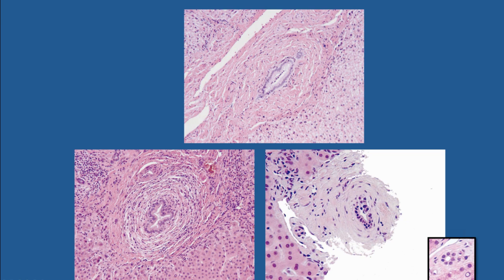So when you have primary sclerosing cholangitis, not only is there fibrosis, but there is also abnormalities of the nuclei or biliary epithelial damage. And that is how one would distinguish primary sclerosing cholangitis from a normal bile duct with a lot of fibrous tissue that it's entitled to. You see how these cholangiocytes actually look very normal and very, very uniform.